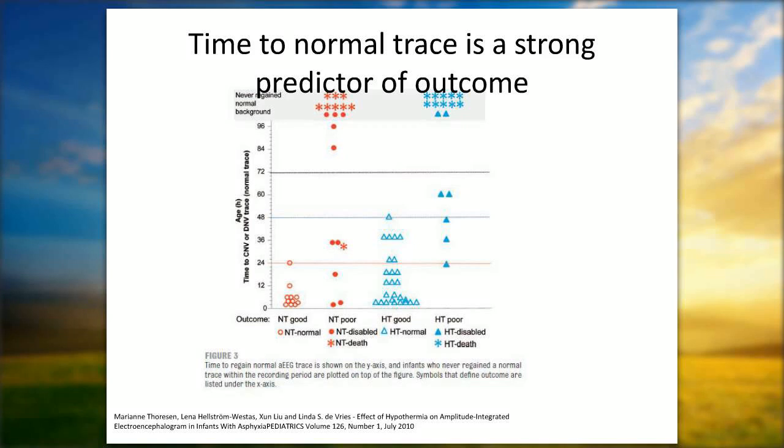Looks like Gabriel is just mentioning that. Thank you. I'm glad you agree. I always wonder if I'm out there by myself thinking these things. You're using aEEG and EEG for all babies with HIE, preterm below 31 weeks. That's great. And babies with congenital heart disease. Oh, great. I love that your neurophysiologists love aEEG. This is fantastic. It's such a simple, powerful tool. I wish everyone would embrace it as much as both of you.